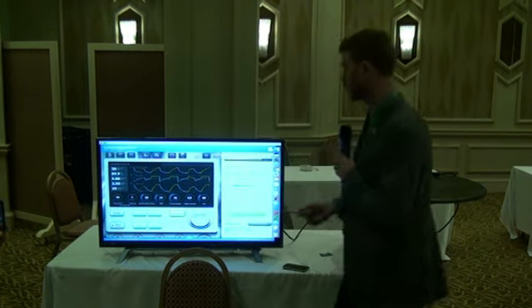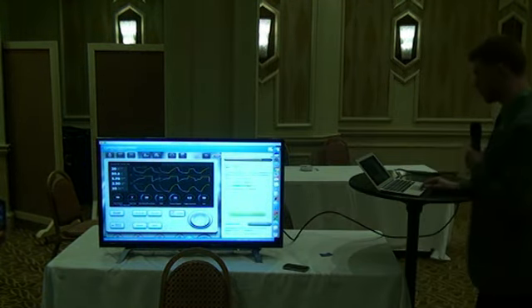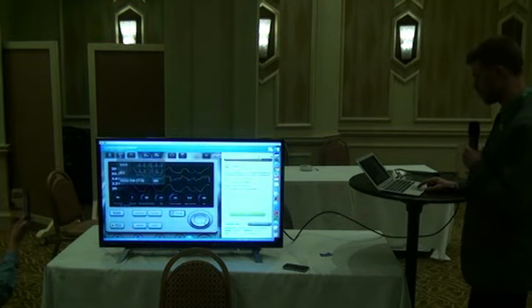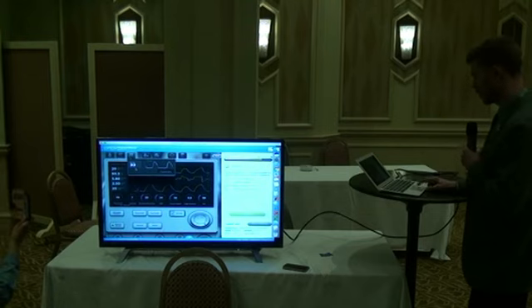So let's look at the monitor values, and then we'll check out the capnograph. So not so bad. And how about that?